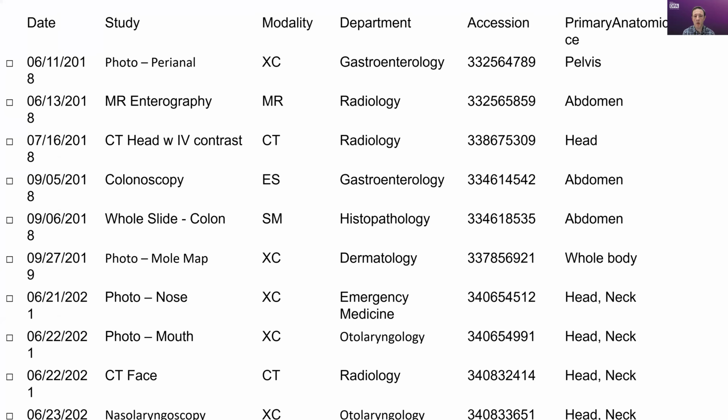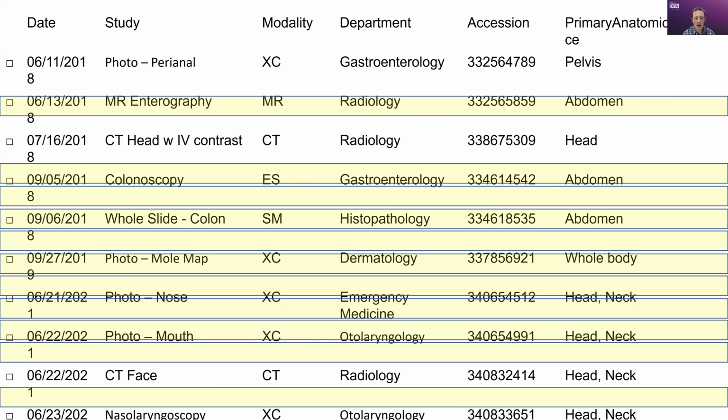And then use that type of information to be able to do something like an image transfer. If the patient needs to go somewhere else for a second opinion or for continuation of care delivery, instead of having information tied into standard metadata fields like this is the study, or say send all the pathology, you could have the information. I'm sorry, the animation doesn't line up here. All the things that are related to the specific disease process.